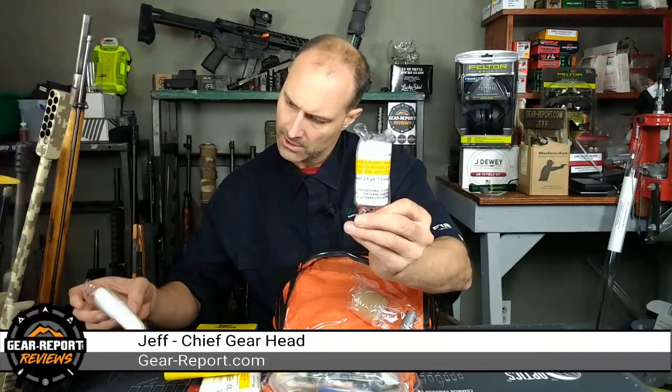Okay, so we have a sterile elastic bandage, 3 inches wide, 5 yards long. I didn't talk about these triangular bandages, which are 42 inches by 42 inches by 59 inches. That's going to make a pretty big bandage. You know, the cravat, you can maybe make a sling out of it or wrap a head wound, a variety of things you can do with that. This is not labeled, but this is that stretchy wrap, if you have given blood and they take the needle out, they put a little piece of cotton on it, and then they wrap the stretchy bandage around to hold it in place, and it sticks to itself. That's what this is.